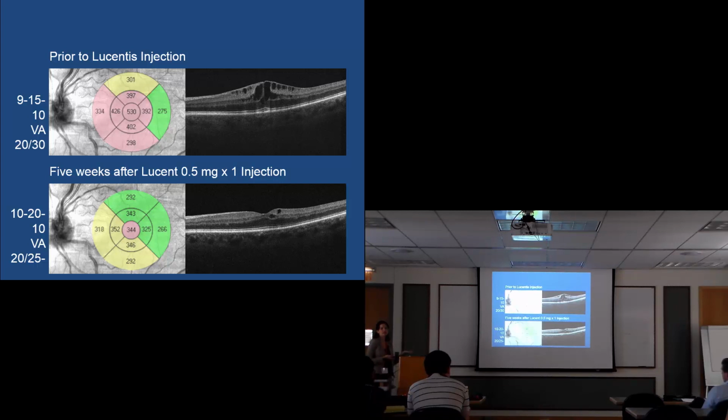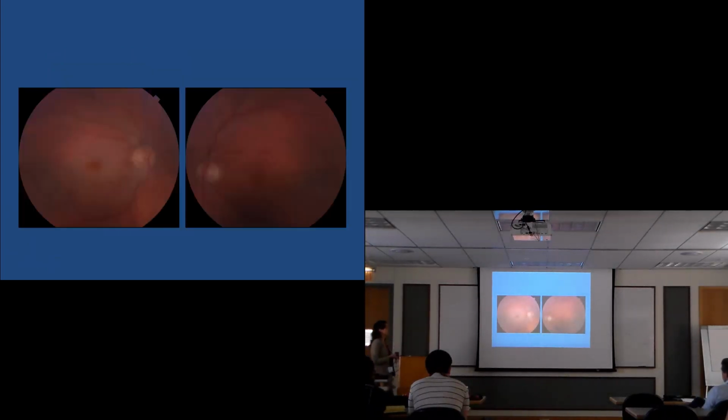So here is how OCT shows the treating physician to stop injecting the same medicine over and over, because injections have risks and you're not getting a benefit. Now you can judge the outcome, and you can show that to the patient. They're more willing to go through treatment, so it's helpful.